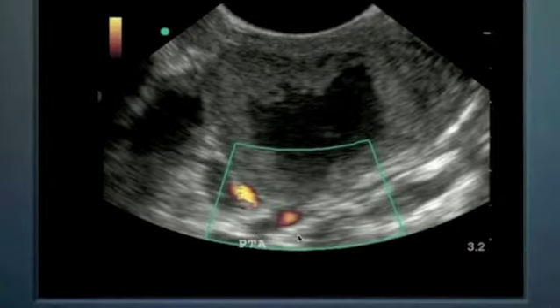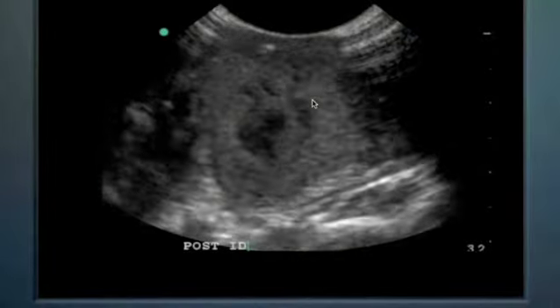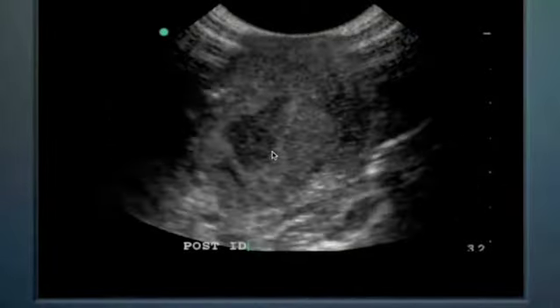So in this case, this is the posterior pharynx here. The distance the needle would have to travel is just over a centimeter in order to get into the space that is the peritonsillar abscess. So we have an idea of how far we need to go when we'll start to see some pus come back. Now as the video plays itself, we can see now that there's almost complete resolution of this peritonsillar abscess.